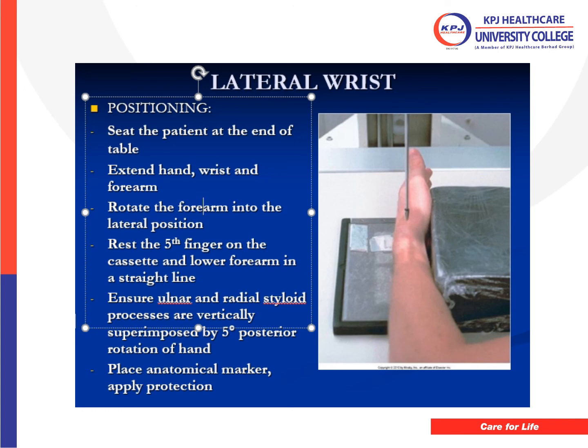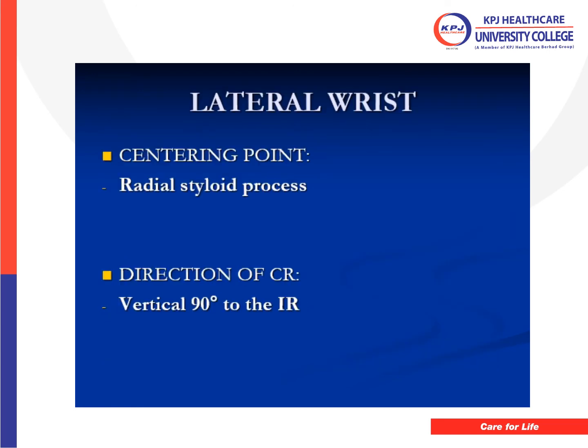Okay, and place the marker. As well apply the anatomic radiation protection. Apply the gonad shielding for this case. Centering point is always the radial styloid process. You can see in a midpoint. I can accept as well or proximal to the radial styloid process, and always directed perpendicular to the image receptor.